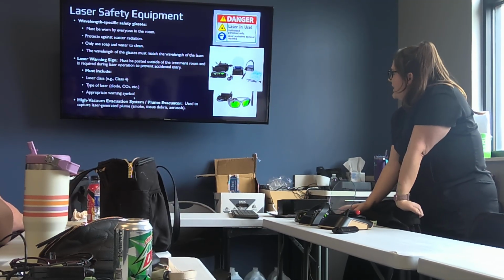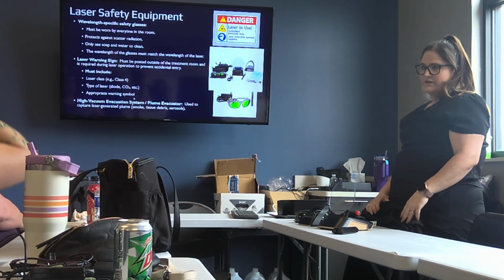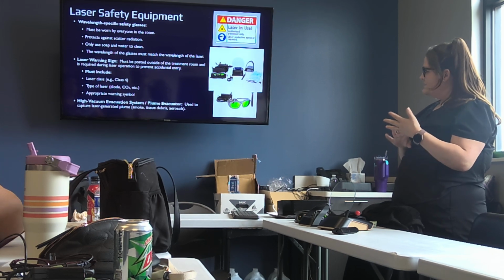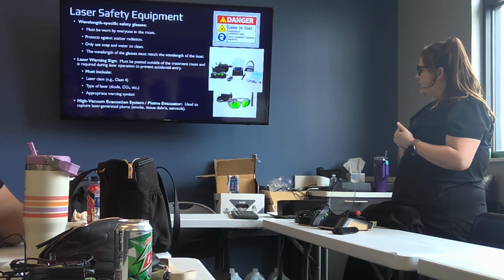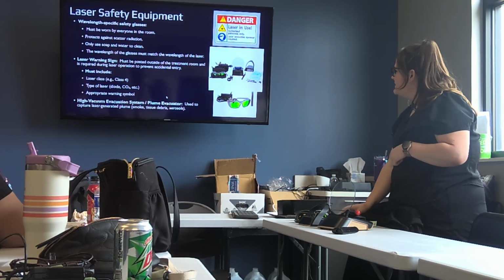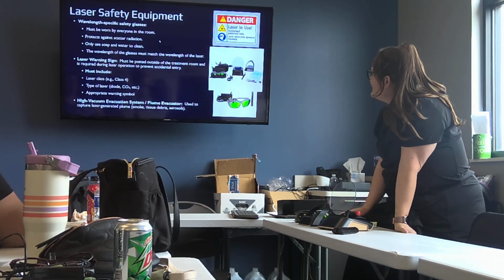And then the high vac system. When you're using the laser, there's a smoke plume that's created, so we have to have the high vac to suck that out. There's also fun stuff like tissue debris in there. And that is basically it.